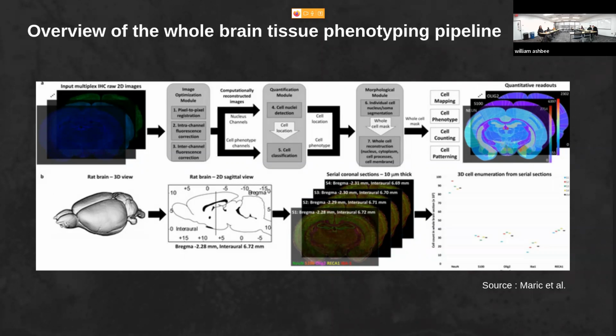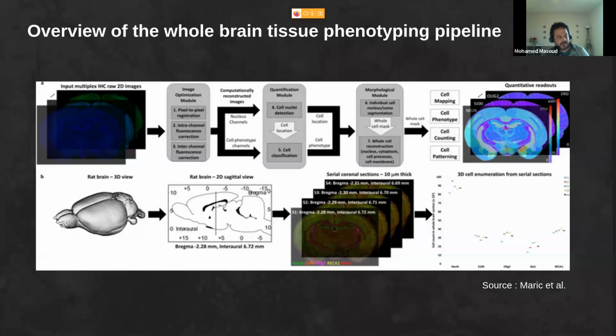How large are these data sets typically? It seems very expensive to generate. It can be large because for each slice we need to find all the markers. In this paper, 10-plex was used, 10 different markers. So for each slice, we need different channels to represent all the cells based on our experimental design.